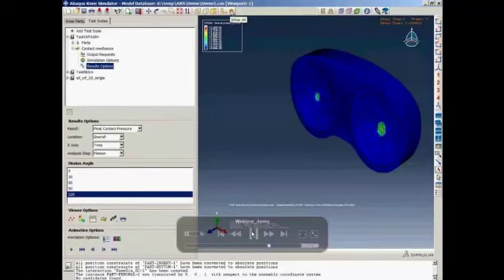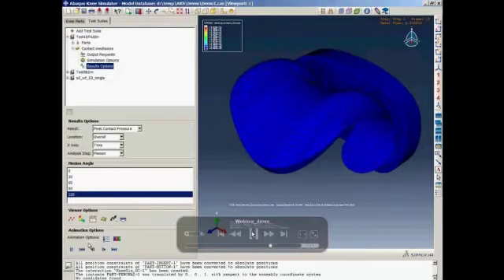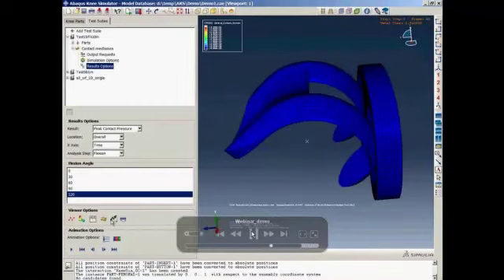They can control which components are being shown. In this case, we have all the components viewed in the viewer, and play the animation again to see how the flexion is executed during the analysis. And another tool is a special tool we created for the knee simulator.